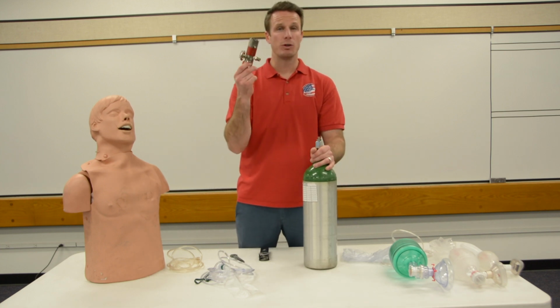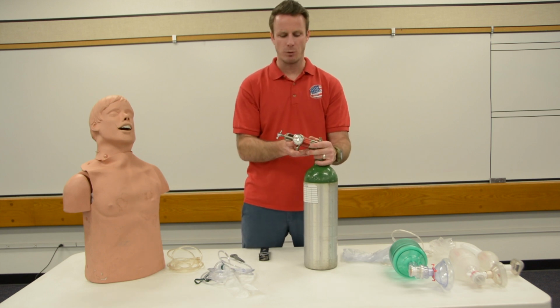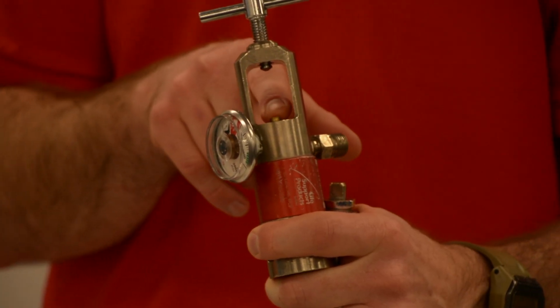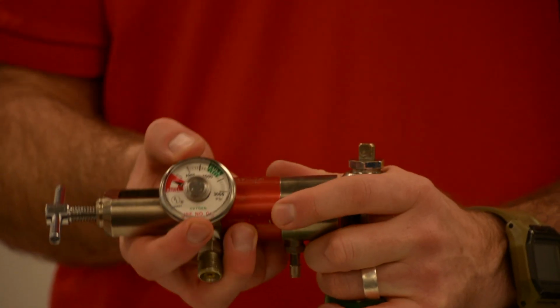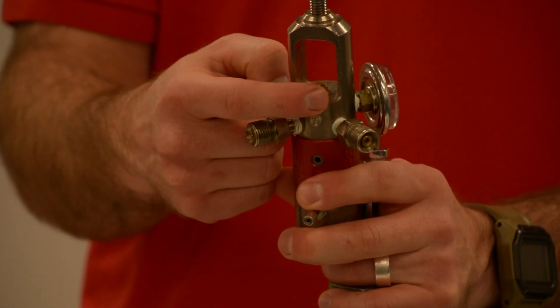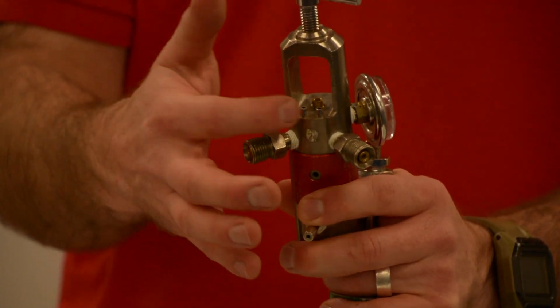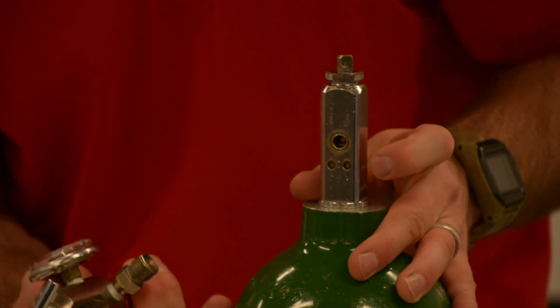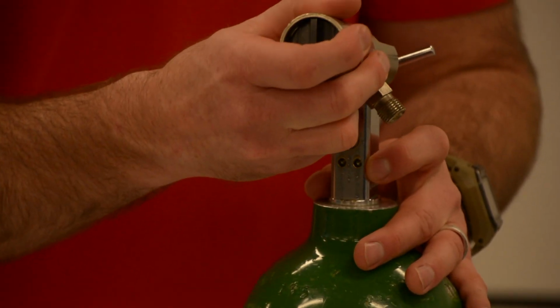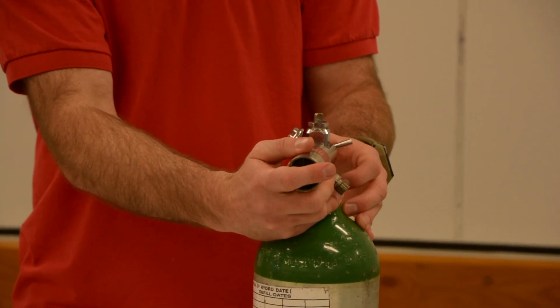After that, I want to hook up my regulator. Now I should make sure that my regulator is also intact. A couple things I check for is, first I'm going to take right up in here, make sure that I've got an O-ring inside of my regulator. I make sure my gauge isn't cracked at all. And then I want to look for these two little prongs right here. These prongs are going to help me to attach it appropriately to my oxygen tank. So these two little prongs should get lined up exactly with these two little holes right next to my oxygen tank. So I'm going to take this, slide it right on my tank, and I'm just going to screw it down.